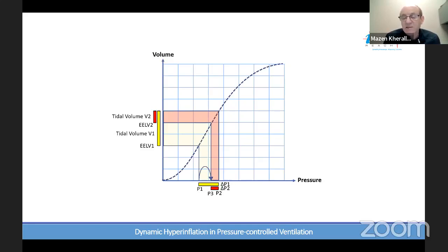Of course, when you add PEEP, now we don't know how much of the added PEEP will actually transmit into the alveoli in terms of auto-PEEP. So if you have auto-PEEP, let's just say you have auto-PEEP of 10, and you add external PEEP of 10. Does that mean that the alveolar pressure is 20? No, not necessarily.